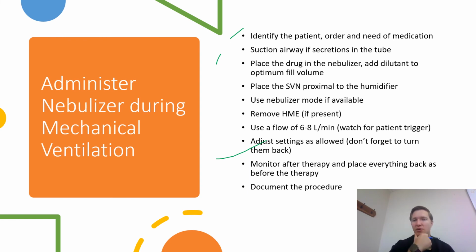If you switch them to an inspiratory pause on the ventilator during volume control ventilation and you added an inspiratory pause with each breath, don't forget to turn that back off, or back to where it was pre-nebulization. So that's a big thing there. If you turn the heater off, don't forget to turn it back on. All those things, so that's if you do those things.